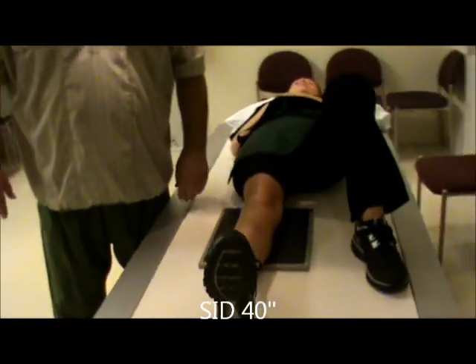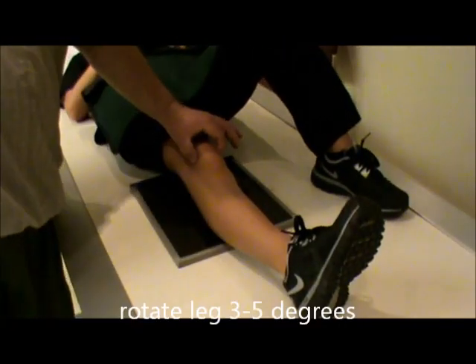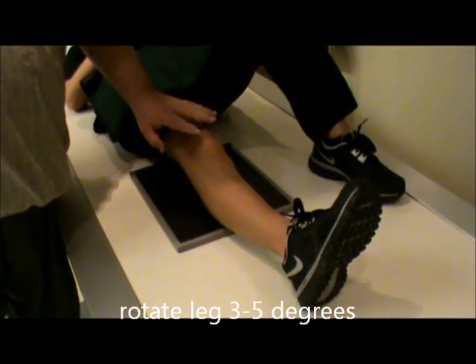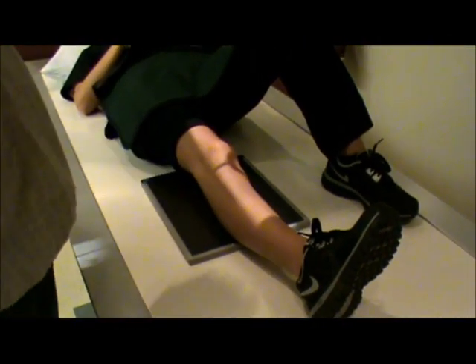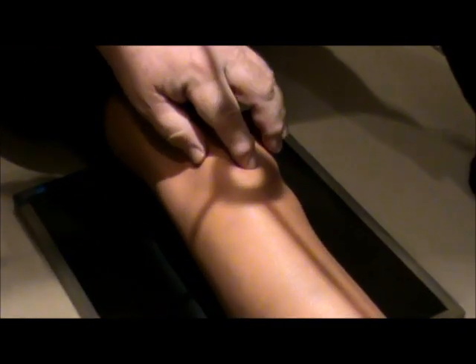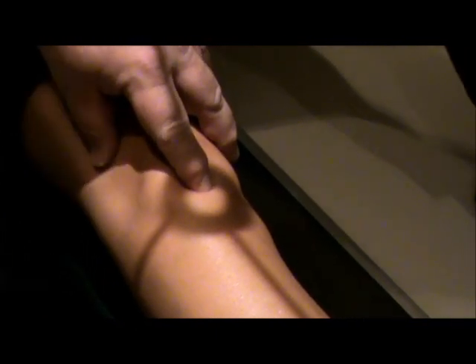Our centering point for our AP — first we're going to rotate the leg in approximately 3 to 5 degrees. What we're trying to do there is get the knee into the true AP position. When you look at the film, the intercondylar eminence should be portrayed in the center of the tibia. Our centering point is going to be palpating the patella and the apex of the patella — approximately a half inch below that is the joint space, and that is our centering point.